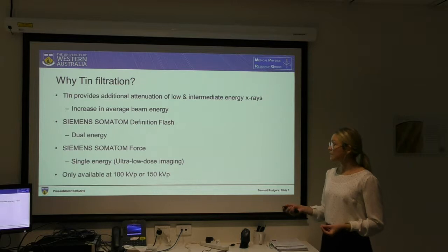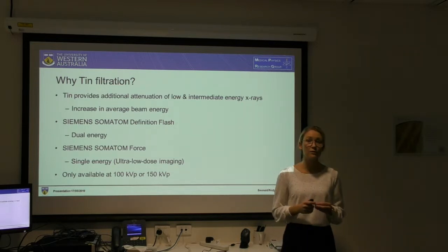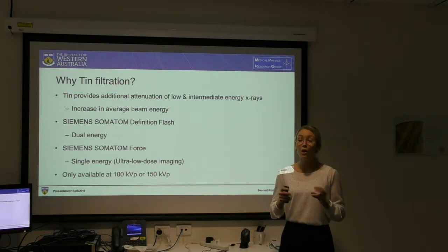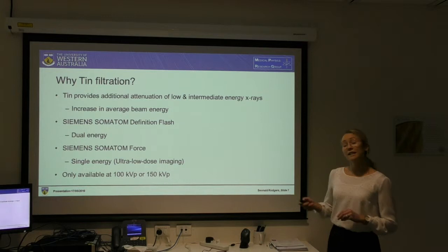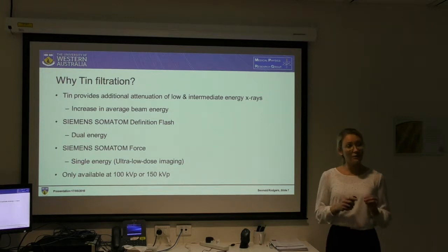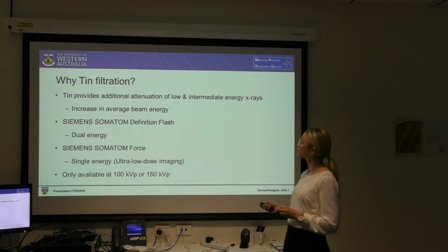It was the release of the Siemens Somatom Force that saw the tin filtration being used for single energy, low dose imaging. In saying that, the tin filter is only available for 100 kVp or 150 kVp.